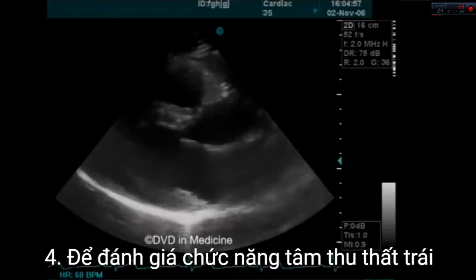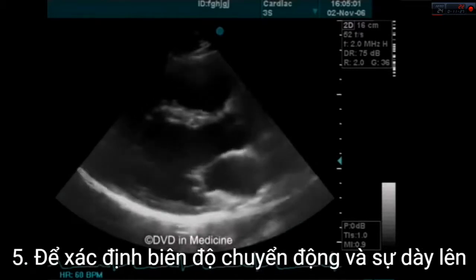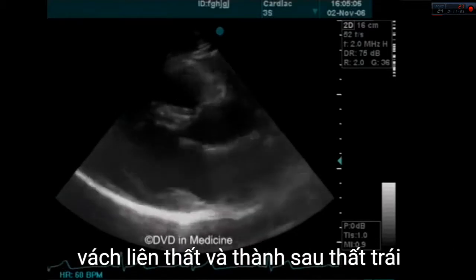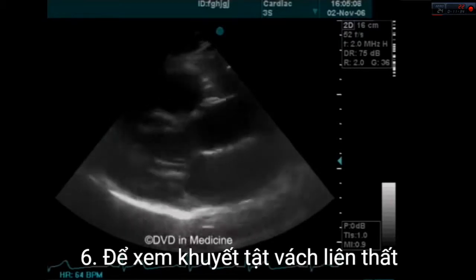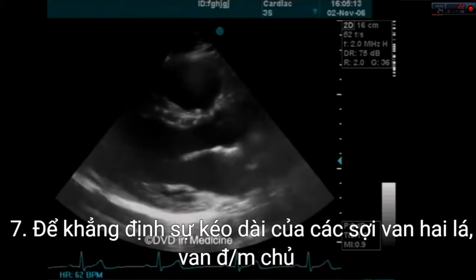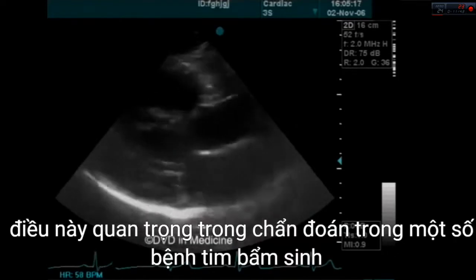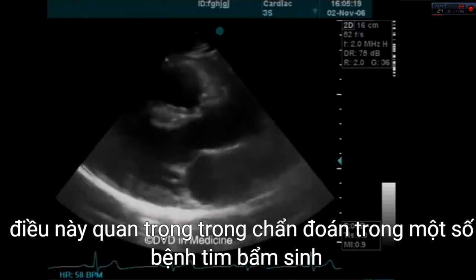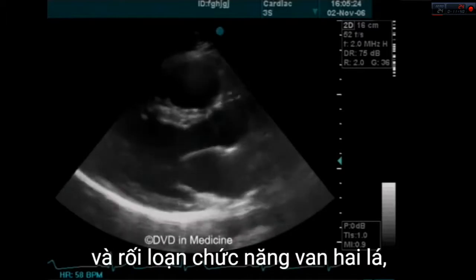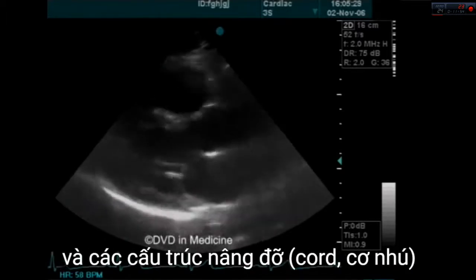4. To assess left ventricular systolic function. 5. To determine the amplitude of motion and thickness of the interventricular septum and posterior left ventricular wall. 6. To see membranous defects of the interventricular septum. 7. To confirm mitral aortic fibrous continuity. This is important in the diagnosis of some congenital heart diseases. 8. To diagnose structural changes and dysfunctions of the mitral valve and its supporting structures, cords, papillary muscles.